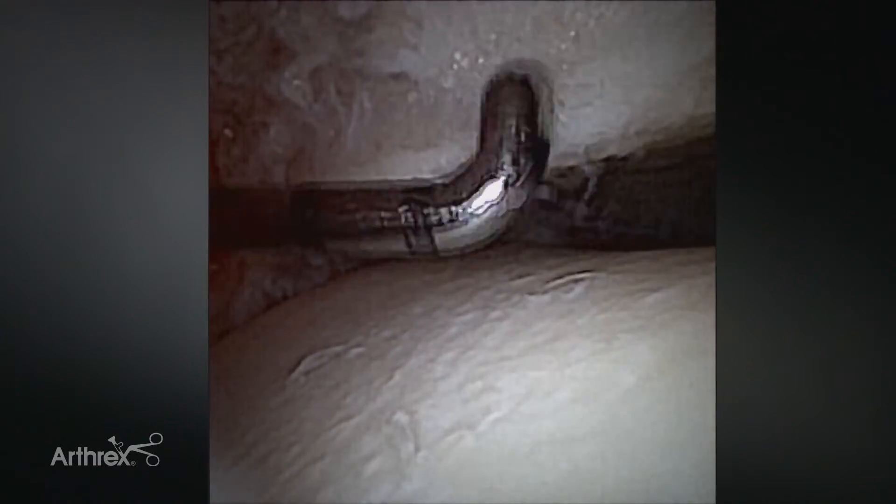We're looking in from the medial portal, looking across the joint. You can see the anterior aspect of the tibia and our talar dome. We can slide the Nano Needle across and evaluate into our lateral gutter. We can check out our syndesmosis right in here — she does not appear to have any instability. We would debride into our anterior fibular ligament. If you're going to do an arthroscopic Broström, you'd insert your anchors here and here into the fibula, which is right here.